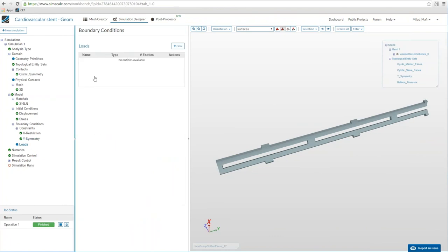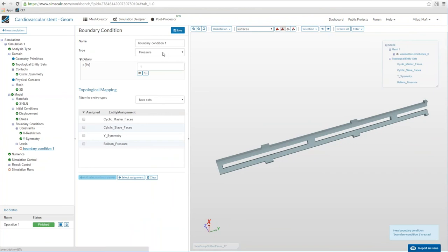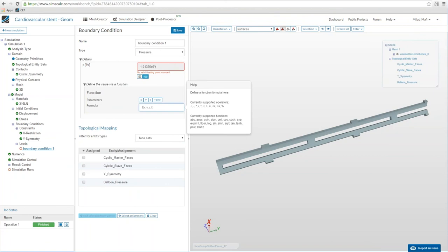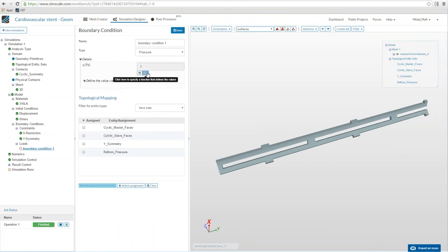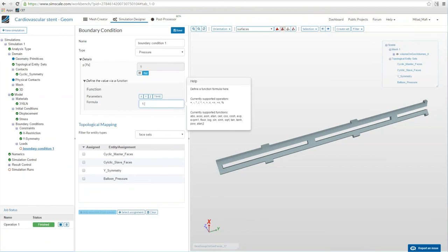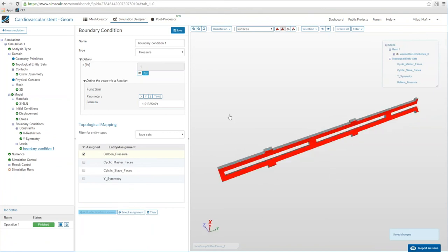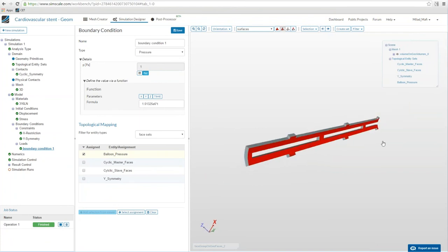Finally we need a load — the load from our balloon. We create a new boundary condition, choose type 'pressure,' and instead of a fixed value we enter a time-dependent formula. We apply it to the balloon pressure entity set, which means a time-dependent pressure — because we want to investigate different steps of this inflation — will be applied on that surface.